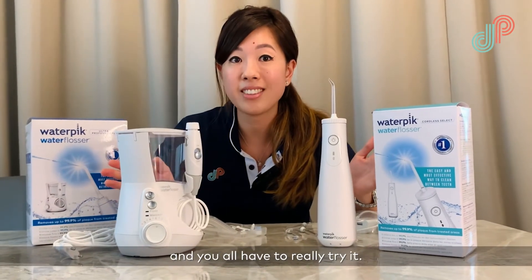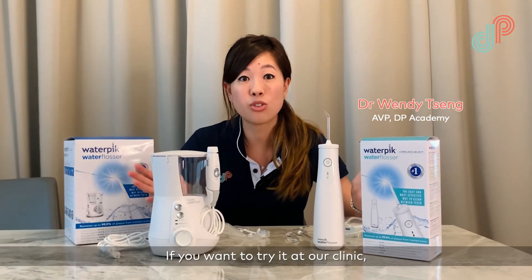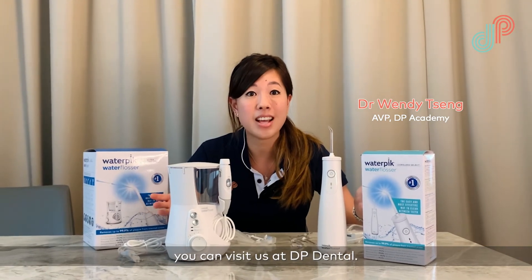It's a really great product and you all have to really try it. If you want to try it at our clinic, you can visit us at DP Dental.